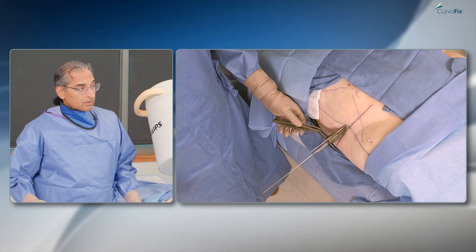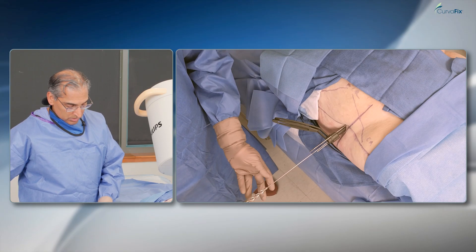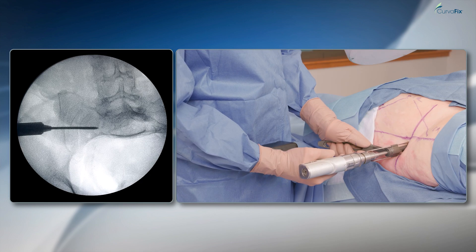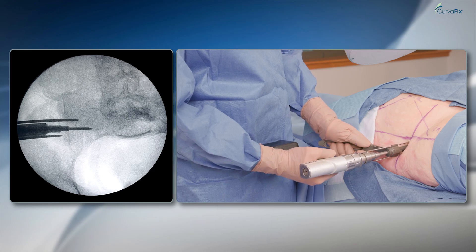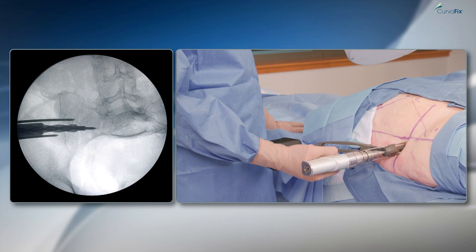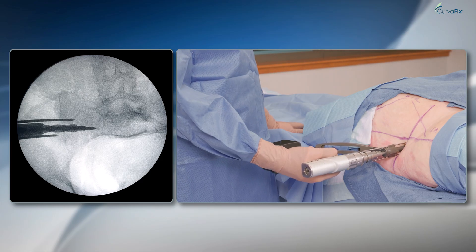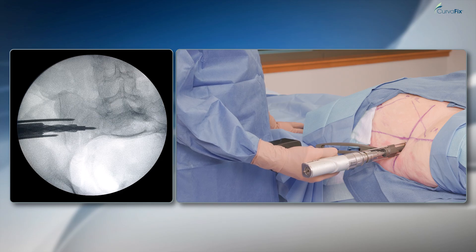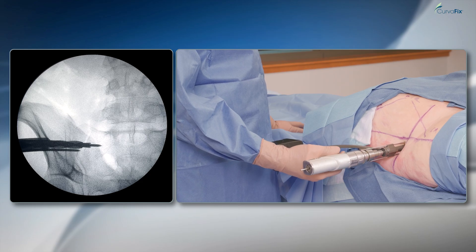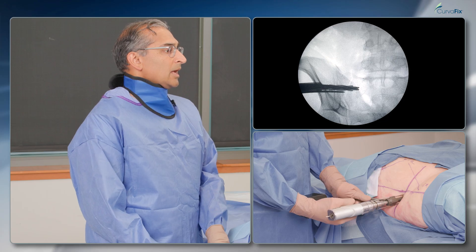I'll take the reamer. Remember, the reamer has a notch on it to determine when and how deep you need to go with it. Hard SI bone there. You can see that I'm down with my notch in the pelvis.